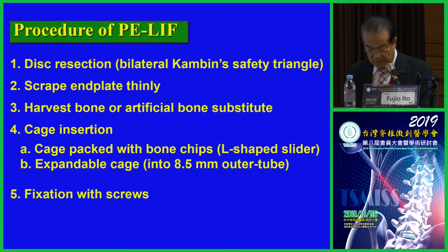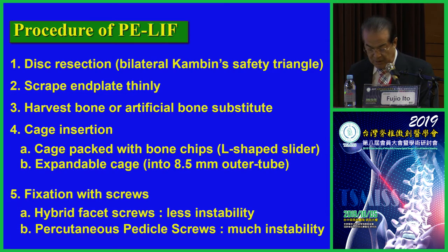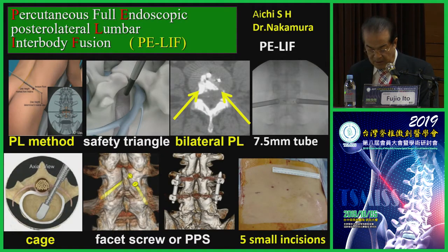Fixation with screws. Hybrid cancellous facet screws are used for less instability cases. PPS is used for fixation in much instability cases, such as spondylolisthesis. Our developed PE-LIF is recommended for DDD, spondylolisthesis, and instability. Total transforaminal discectomy is easily performed through bilateral Kambin's safety triangle. One or two cages are transmitted into the intervertebral space along the specially designed L-shaped carrier.